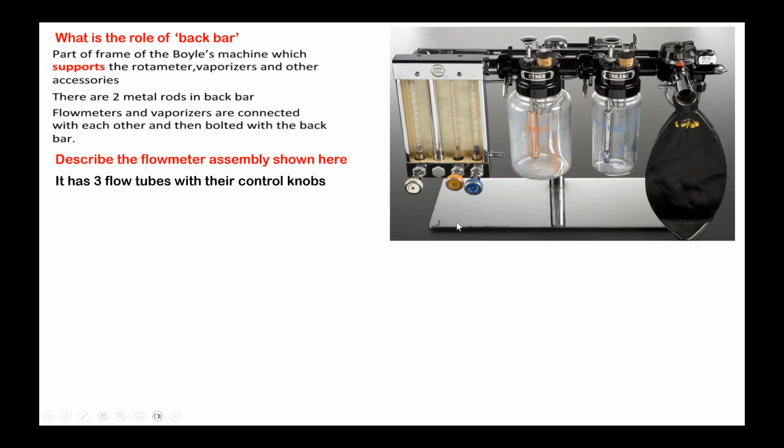This picture is more of historical importance. Some hospitals may still have machines like this, which they prefer to keep to see whether the students are able to identify them. Ether, sir. Ether is a liquid. Ether is present in this bottle. Halothane. It is not a gas. Flow meters are mainly for gases, not for liquid anesthetic agents. Liquid anesthetic agents are dispensed by vaporizers.